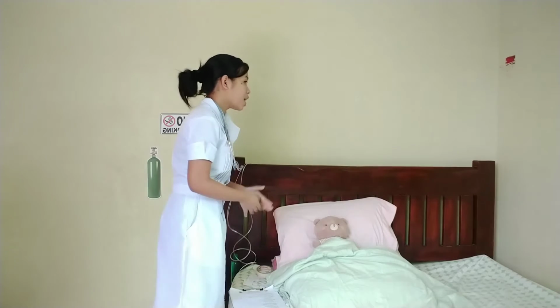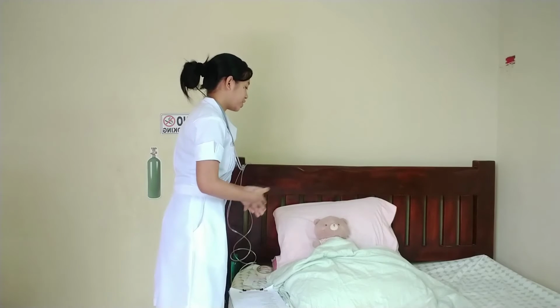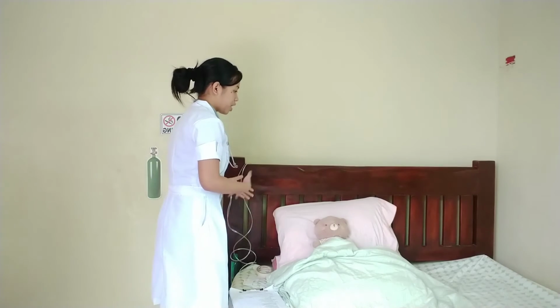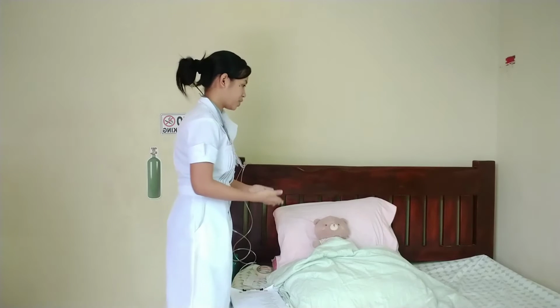Okay, ma'am, thank you. Let me just double check that you already signed a written consent for this procedure. Am I right? Okay, ma'am. So oxygen therapy will help you or will give you more comfort and help you in breathing.